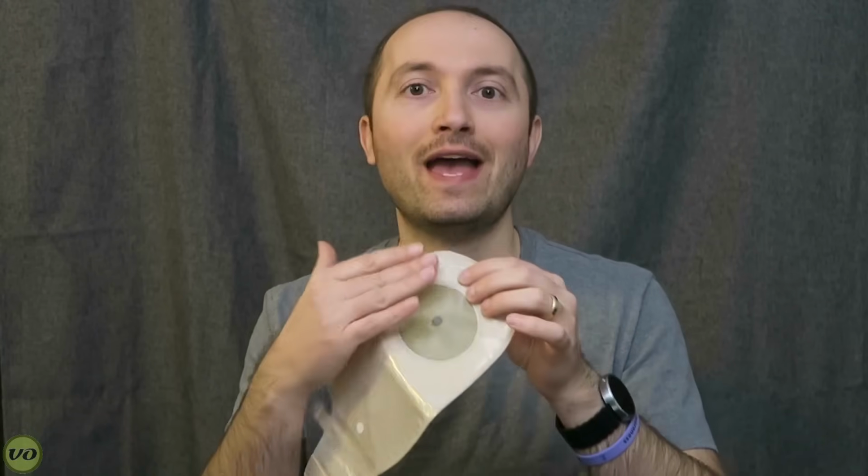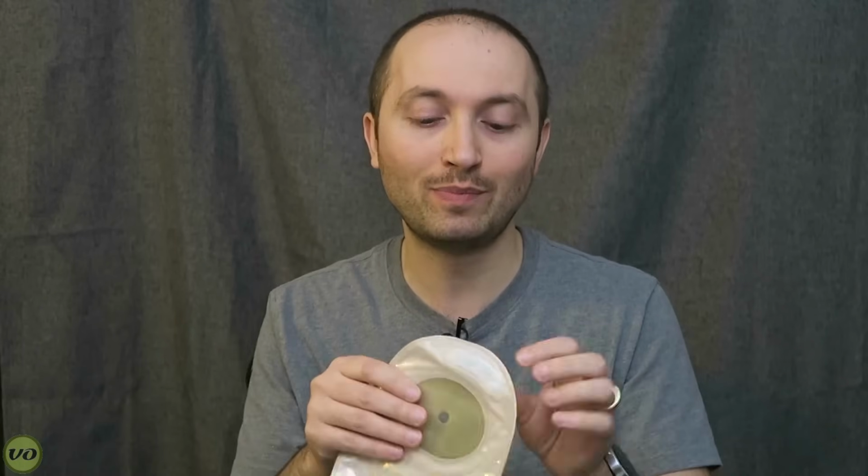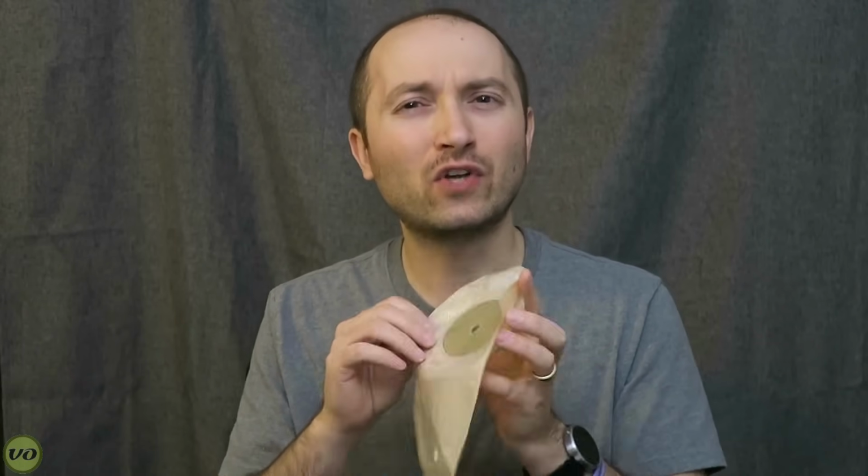Now, some people might find it a challenge, especially if they have an opaque bag, because they can't really see how much of the stoma is being exposed or how much of the skin around the stoma is being exposed. It's hard to get a perfect fit when you can't see what's going on like you can with a two-piece. So that's one disadvantage to this.